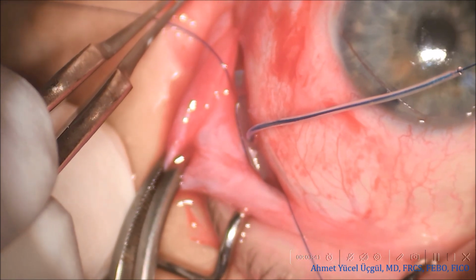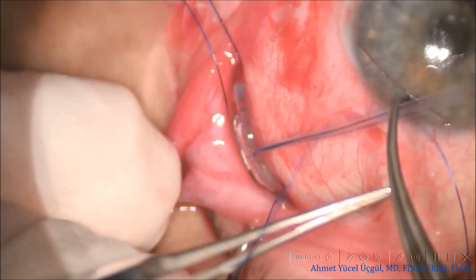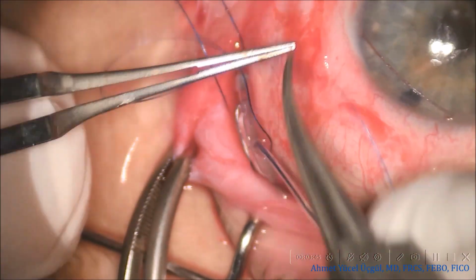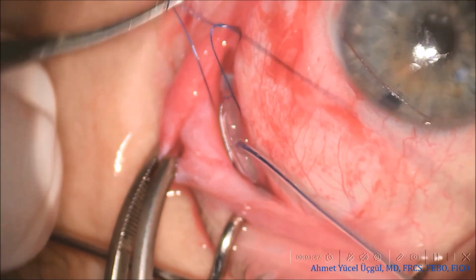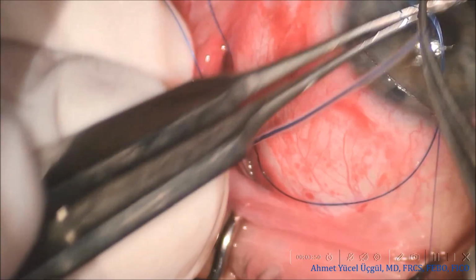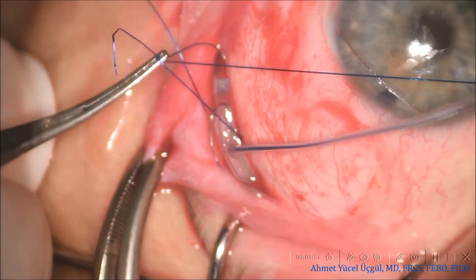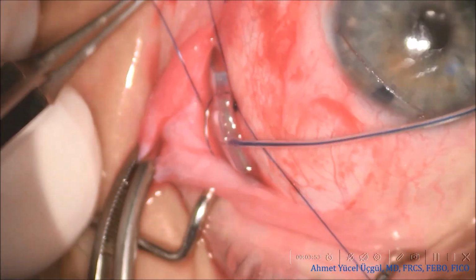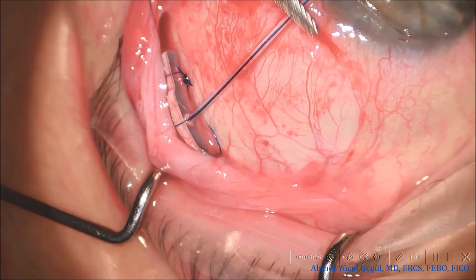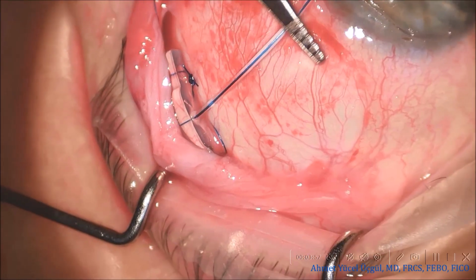I also use Prolene rather than Vicryl for plate fixation, as my goal is to achieve better long-term implant stability and to minimize the chance of later plate movement, including movement related to eye rubbing or external mechanical forces. Another reason I prefer the horizontal mattress configuration is that it brings the plate into broad and firm apposition with the globe, allowing the implant to conform more closely to the scleral surface.